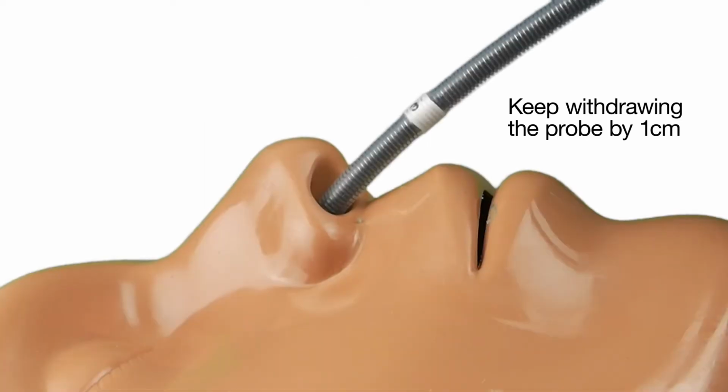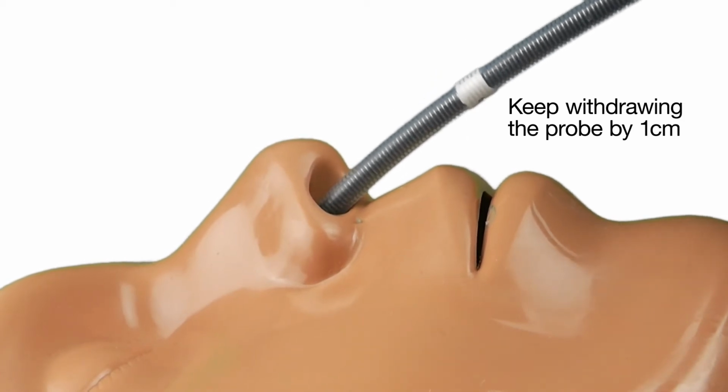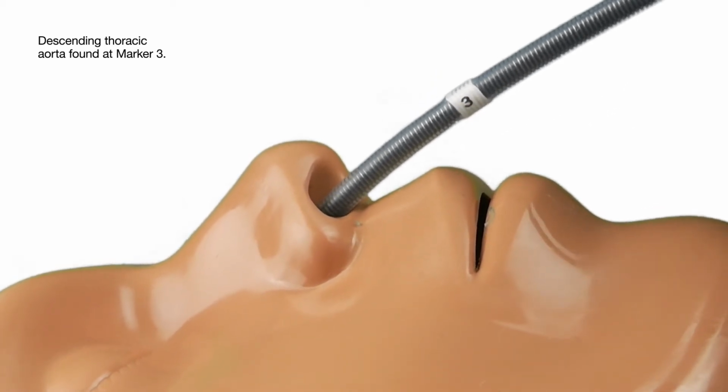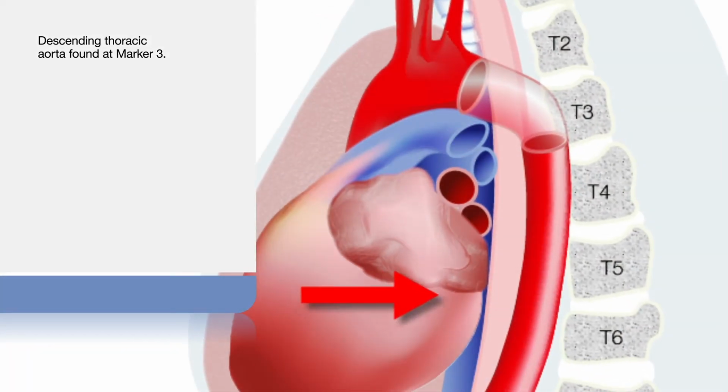Keep withdrawing the probe by 1 centimeter until you find the correct signal, changing the direction of rotation each time. The esophageal window to the thoracic descending aorta is usually found at T5 to T6 in patients. This is positioned around marker 3 in the ODS, so only small rotational adjustments should need to be made.